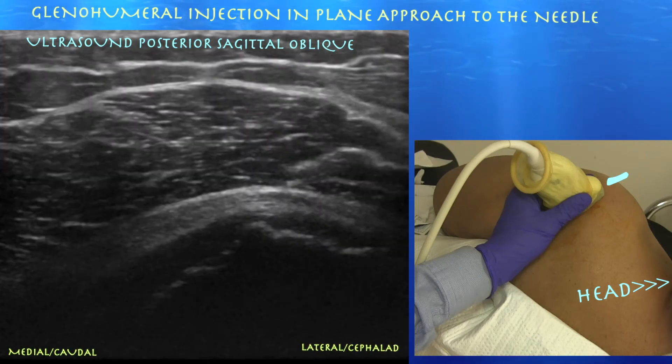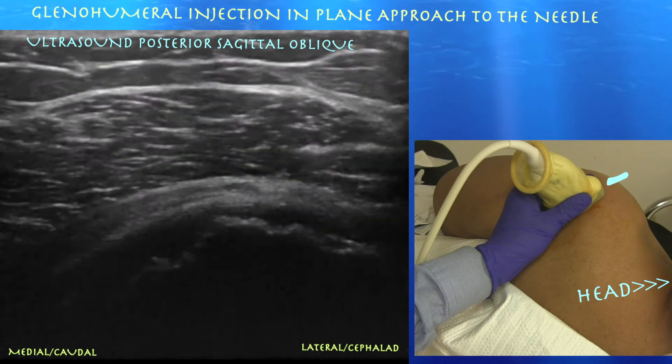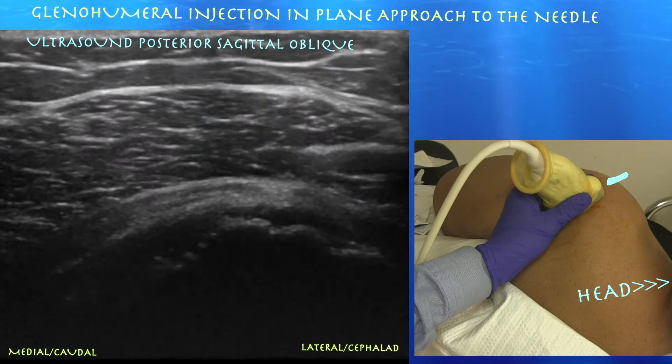Here we're going to go over a glenohumeral injection in-plane approach. Here we're pushing with our syringe on the lateral deltoid, and here we're actually starting the procedure.